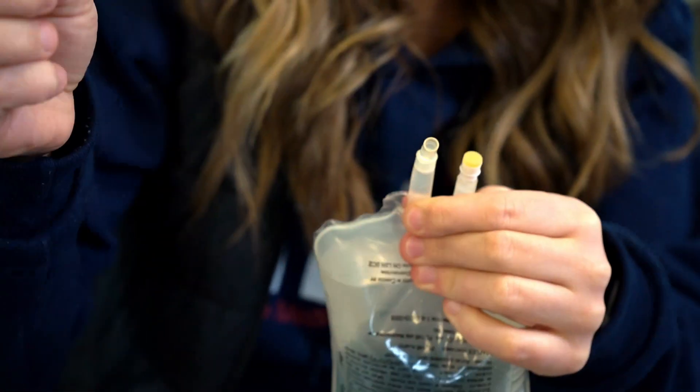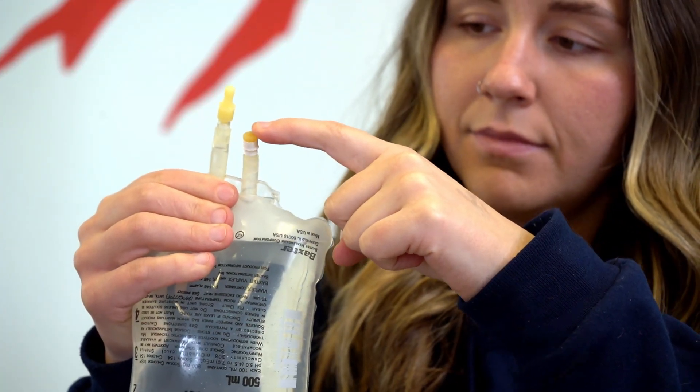Pull the tab out of the bag while holding it upside down so it doesn't spill. Most bags have two ports — one for the IV line and one for the medication. Make sure that you're pulling the tab from the IV line port.